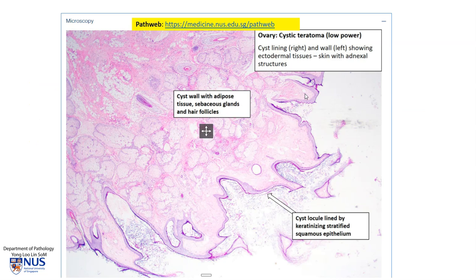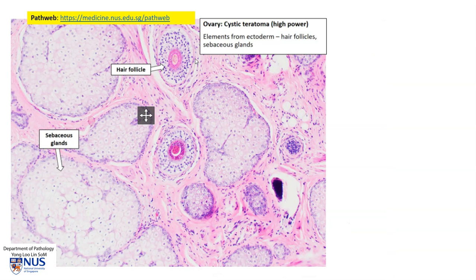Microscopically, they can contain many elements. Very often they have skin and adnexal elements. Here is the epidermis, which is stratified squamous epithelium, and these are all the sebaceous glands. Often these cyst locules accumulate a lot of oily material because of secretions from the sebaceous glands. We can also see some hair follicles here, and here is a closer-up example where you can see the hair follicles with the hair shaft in the middle. And these are the sebaceous glands.